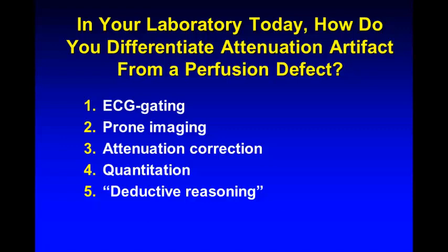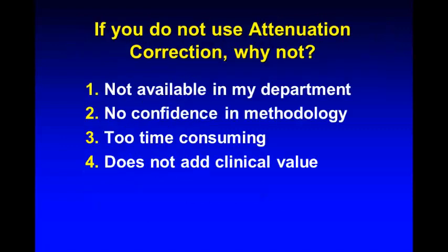A quick poll here. I understand that there are some SPECT CTs in this country, so I want to ask, how do you differentiate your attenuation artifacts from perfusion? Who uses EKG gating? We will do it by a raise of hands. Okay, who's using prone imaging? All right, good. Anybody using attenuation correction? Quantitation and deductive reasoning. So it looks like there's not a lot of attenuation correction.